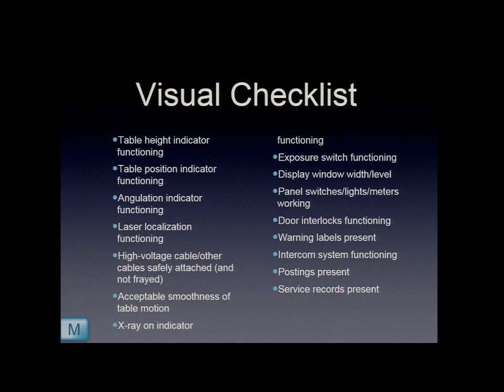The display window and level. If you're doing all that, is that getting sticky because somebody dropped a Coke and it's all gooey and it's going to jam up, so it needs to be cleaned? Or is it now just so old that it's no longer functioning? And so things like that need to be documented.